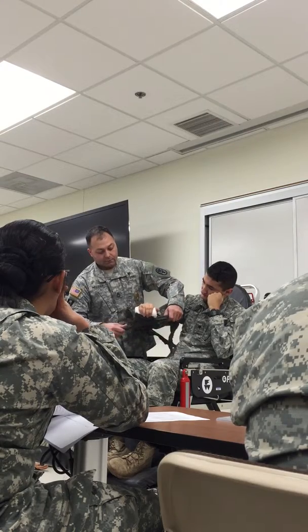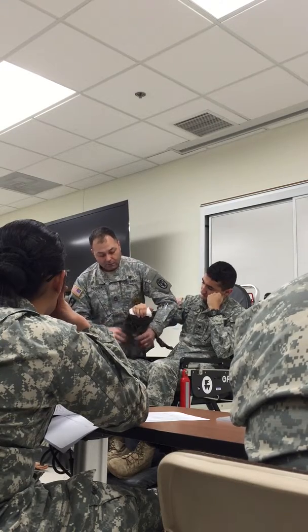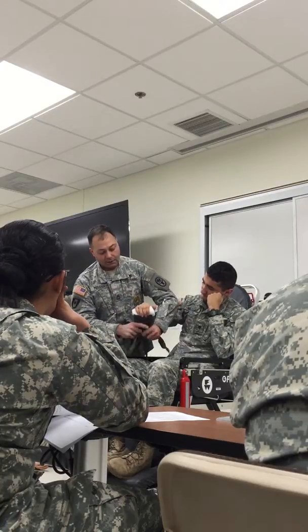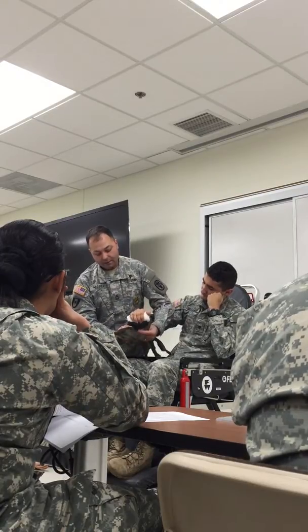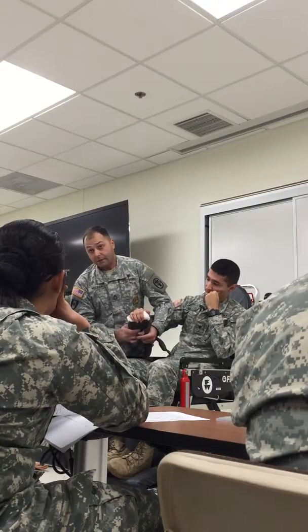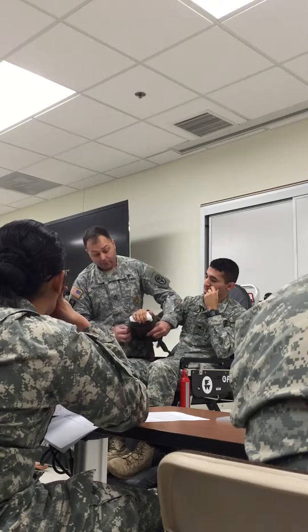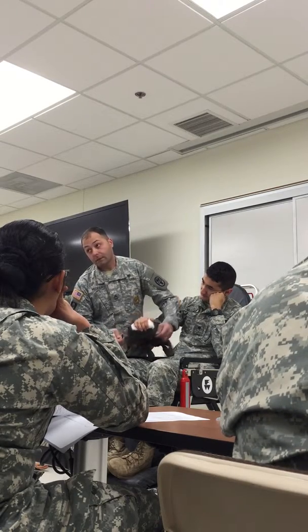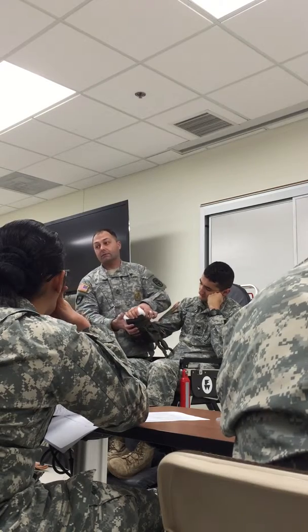So two closest to the wrist and two on top of the forearm? Right. Now, keep in mind that you don't want to cut off circulation, and you still need to check the pulse. It says in here, check the pulse after each cravat is applied. So every time you do that, you have to check the pulse.